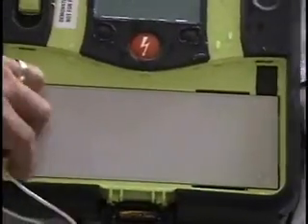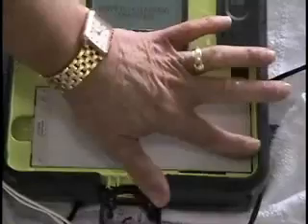You want to open the battery case? All right, let's see. You'll also see that as we removed the battery cover, the only water that was in the battery well itself was on top of the battery, and that was from dripping off the top of the cover. The inside of the battery well is as dry as a bone. As you can see, there's no water.